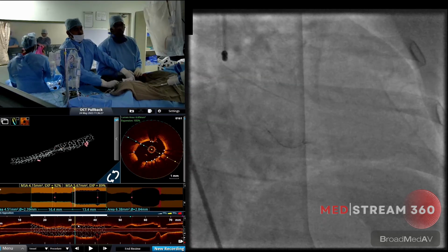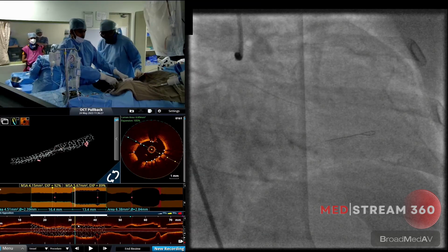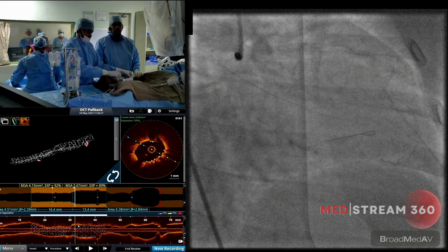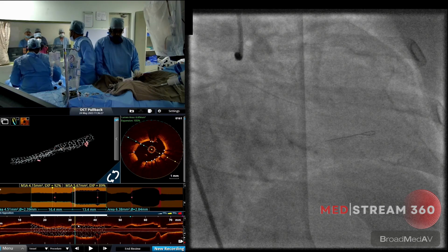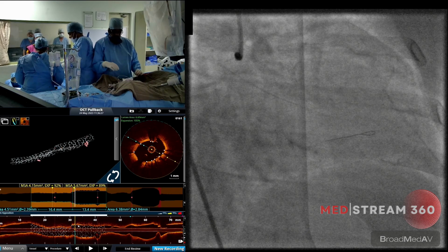Though the plaque is extending up to the ostium of the LAD, we found a good landing zone at the mid portion of the LAD, where the 180-degree arc of EEM is visible. We sized according to the distal reference diameter, and we did the POT according to the proximal reference diameter. Then we finally checked the expansion, dividing before the diagonal and after the diagonal.